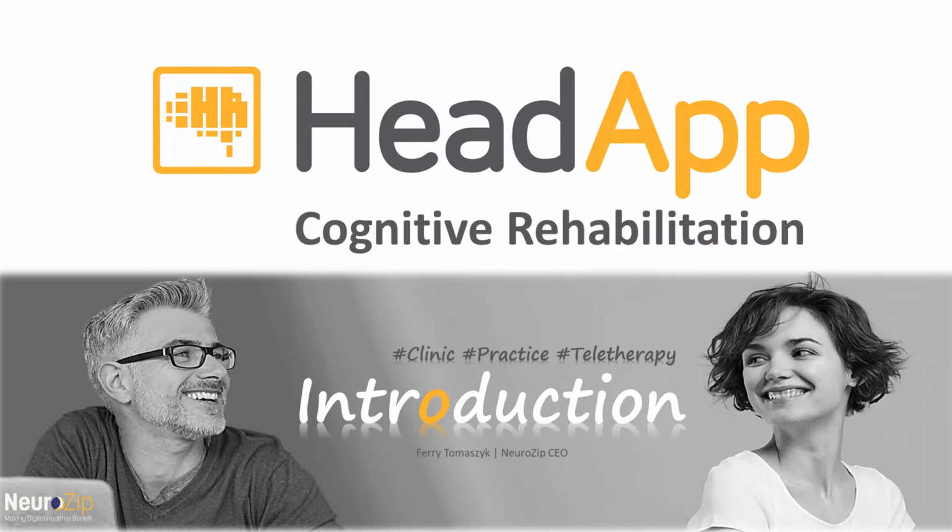In this webinar, you will be introduced to HeadApp, learn more about its distinctive features, along with how to implement the program in a rehabilitation setting. The webinar will have two parts. In the first part, I will give you a brief overview about HeadApp's therapeutic approach, the features and advantages. In the second part, I will introduce you to the ease of use in the software themselves.